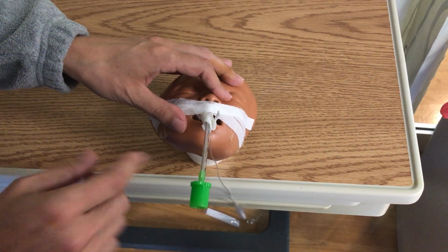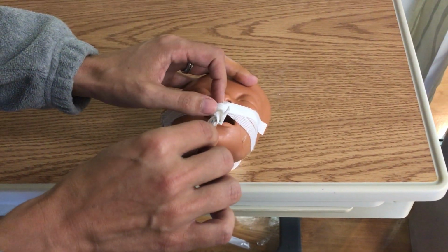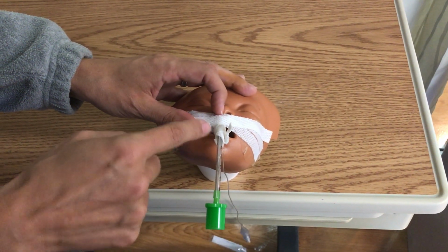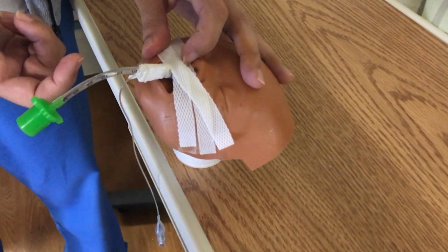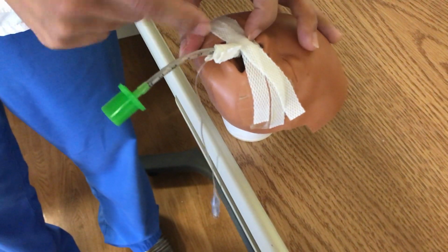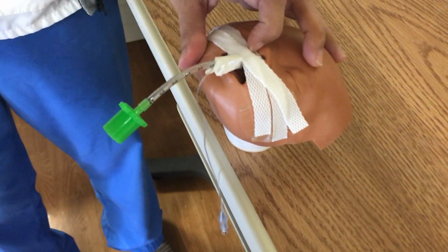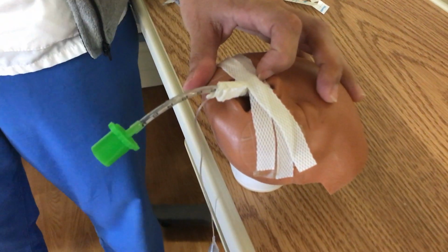You're putting the patient at risk for an unplanned extubation because you really don't have a lot of contact between tape and tube. You have gaps that secretions can get into, and as a result, this tube is able to slide out through the tape, and then you'll end up with tape but no tube.